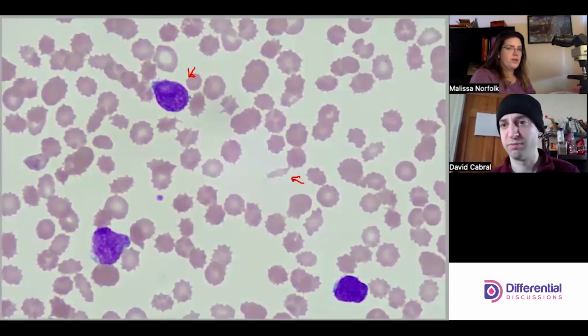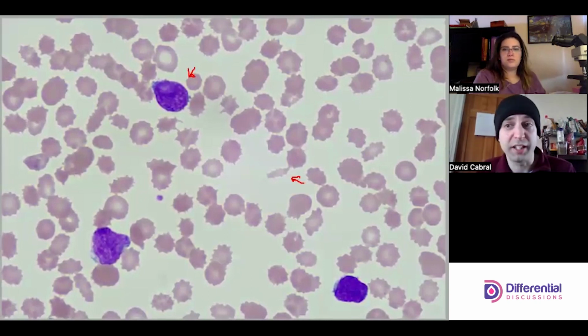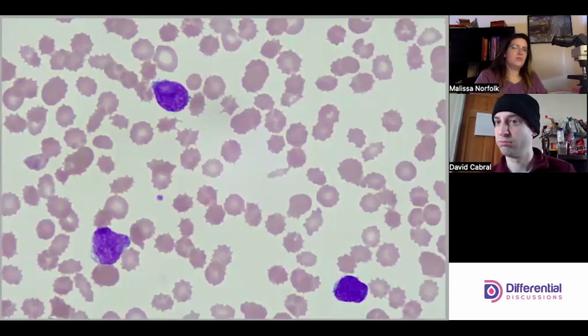Yeah. He's not proving it. Right. So I think he fails that. But if this was the only cell I saw, the first cell I saw on the slide, it might just get me in the zone, but I wouldn't necessarily say blast right away. But I would call it a blast given the context. Agreed.